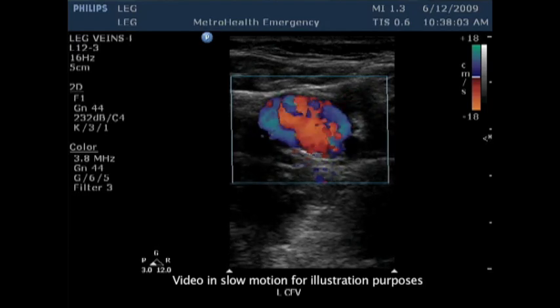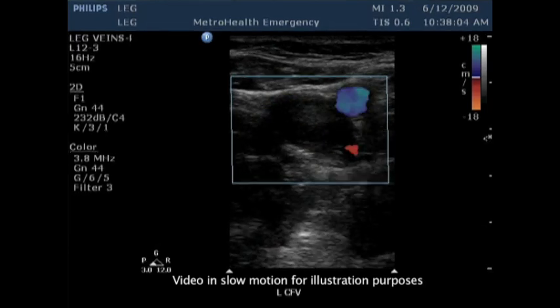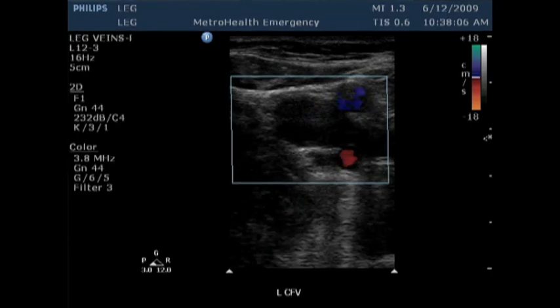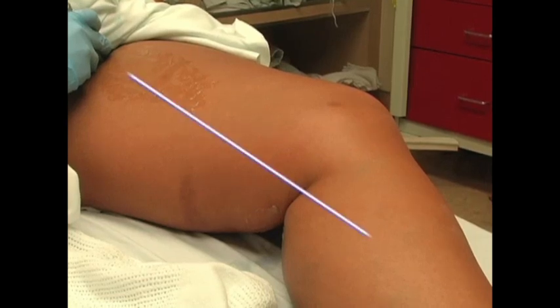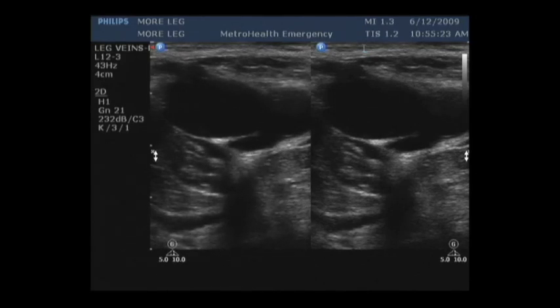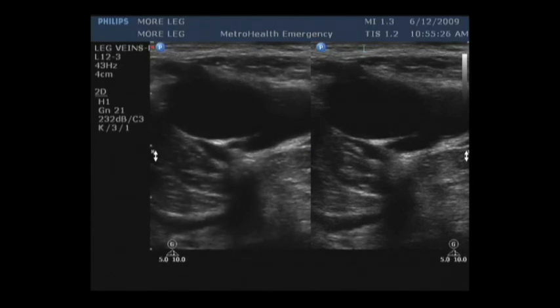This produces a bolus of blood that is propelled toward the heart and is seen near simultaneously as a color blush that completely fills the vein. A small blush, or the absence of a color blush in the vein, suggests the presence of a thrombus at some point between where the calf was squeezed and the position of the transducer, and should direct you to investigate further for thrombus.